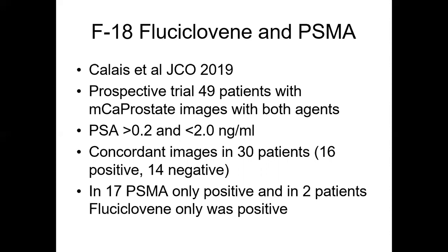And in 30 patients, there were concordant results, but in 17 patients, the PSMA was positive, and in 2 patients, the fluciclovine only was positive. So this may depend on the fact that we know that some patients can be PSMA receptor negative, in which case other agents such as fluciclovine are useful.